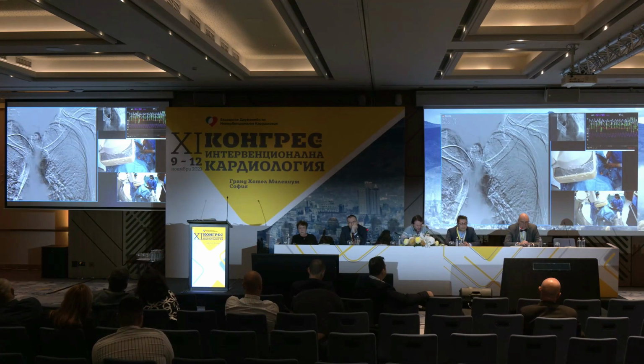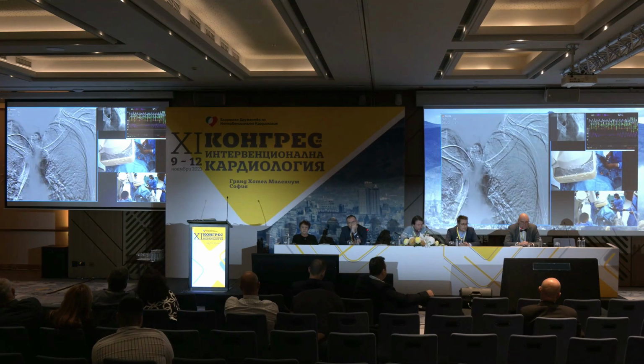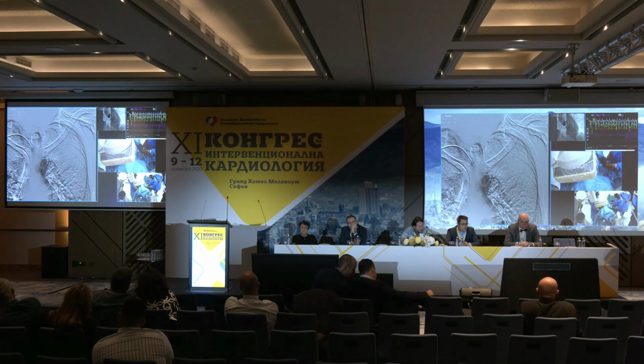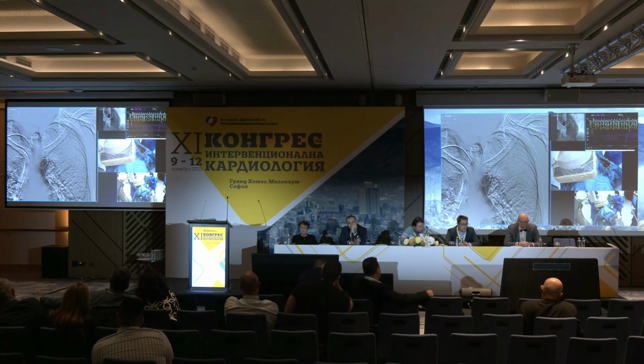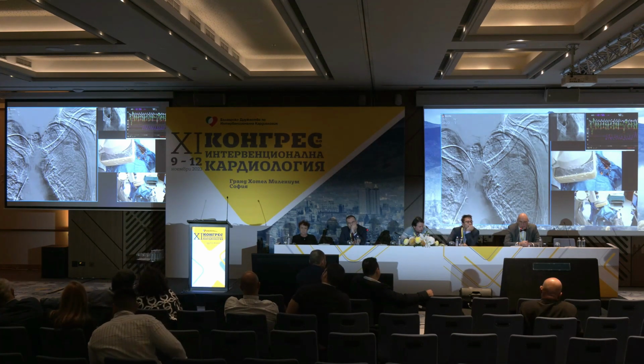And I mentioned in the beginning that absolutely by purpose we did axillary and not subclavian access in order to have easier compression and hemostasis, because the axillary artery of this lady is very close to the skin. So we are compressing a little now.